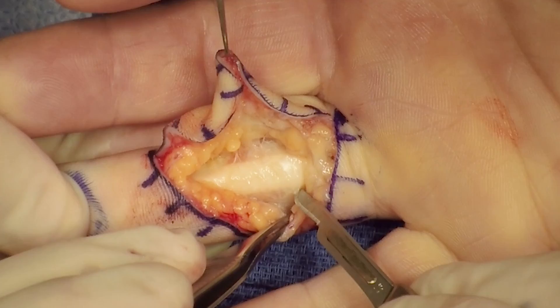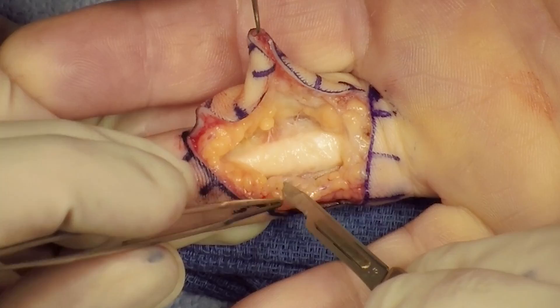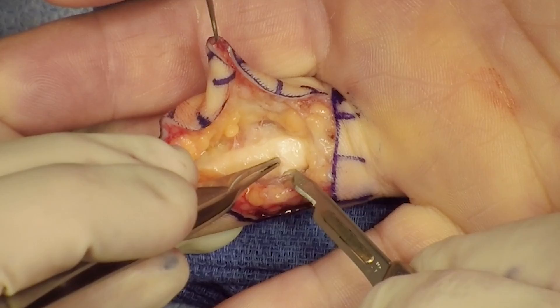The interval between the A2 and the A4 pulley is entered. The flap is elevated and preserved. This will be used later to restore the smooth gliding surface of the flexor sheath.